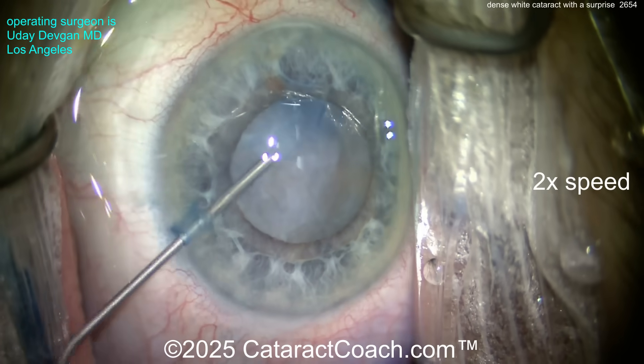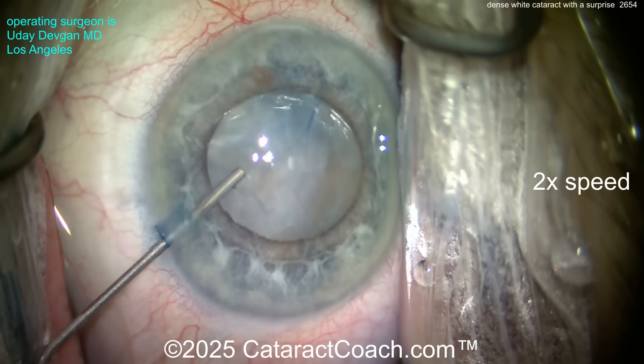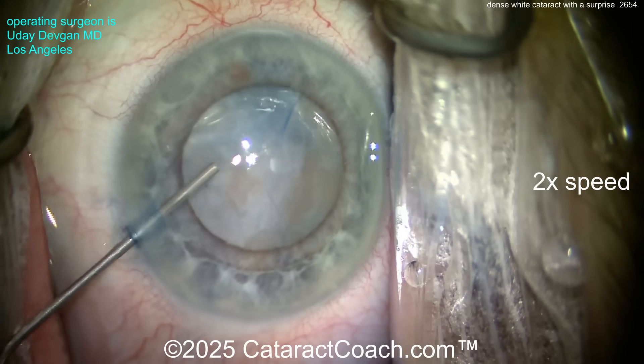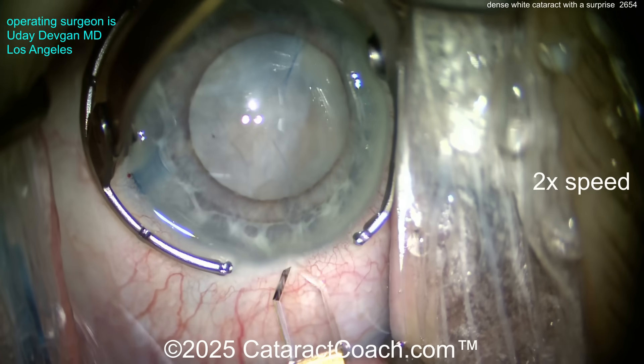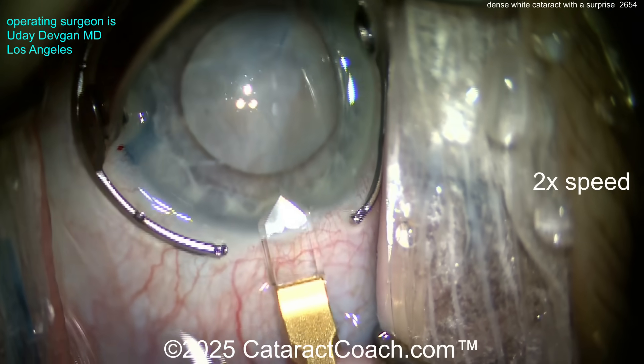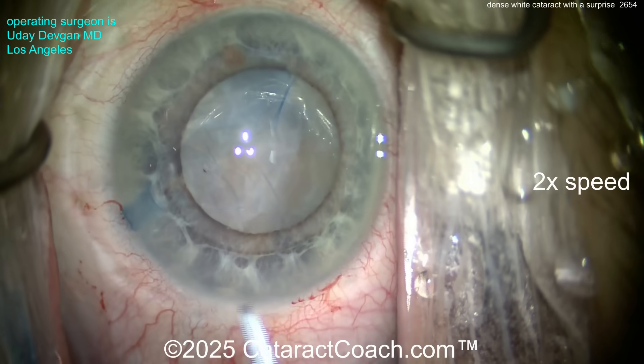Now look at the lens capsule — what do you see? There are some fibrotic bands on it. This patient has had such a dense cataract for many, many years and just never wanted surgery — afraid of surgery. So finally we're doing it now, but you can see those fibrotic bands. Let's see what happens when we try to get the rhexis done.